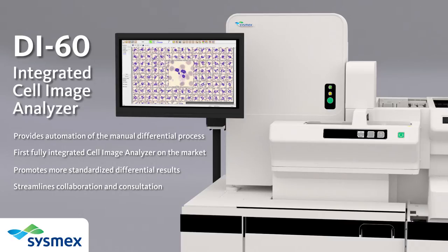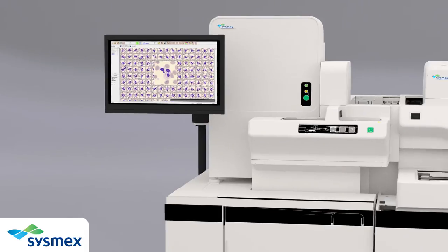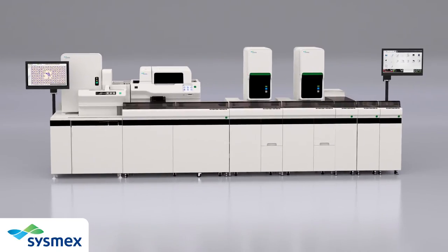The XN series compact design delivers a smaller footprint for increased productivity. The DI60 is able to connect directly to the Sysmex XN3000 Compact Automation System or to the XN9000 Scalable Automation Platform.